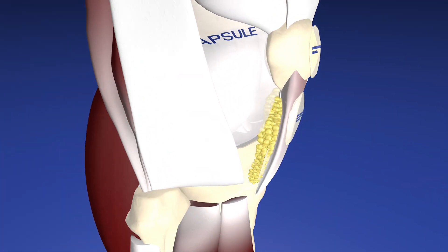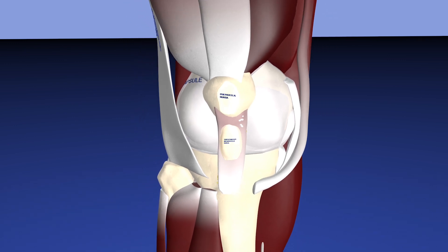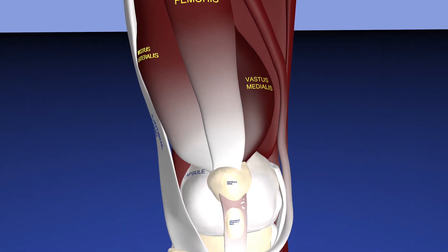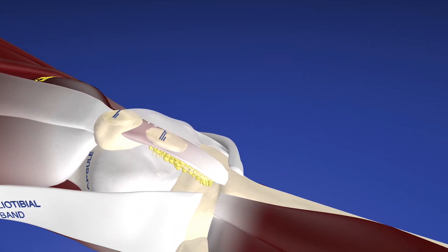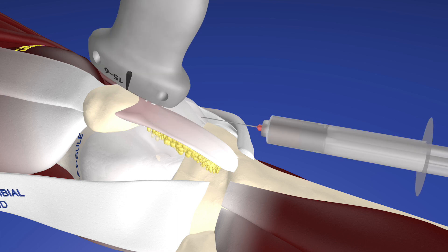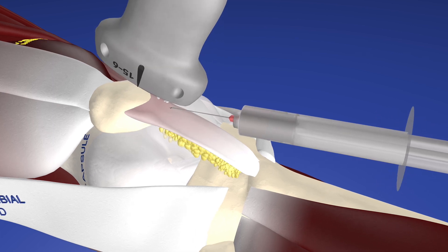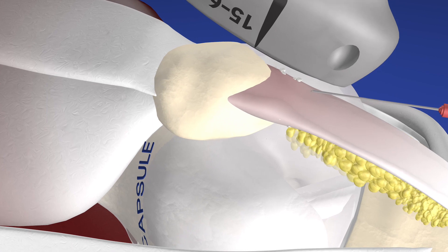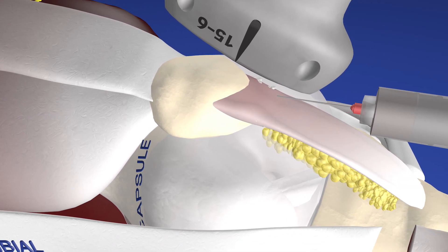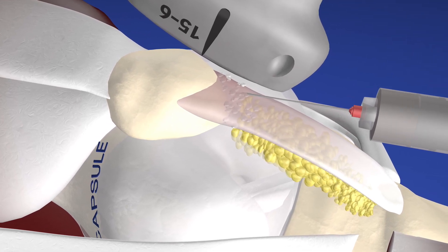Here's our Hoffa's fat pad again and some of the structures being brought back. Here's our quad musculature. Now we're bringing the leg into position and starting the initial part of the procedure, which is essentially a platelet-rich plasma injection just superficial to the tendon. Here we are starting the needle fenestration or tenotomy, which helps elicit a healing response as it causes the tendon to bleed.